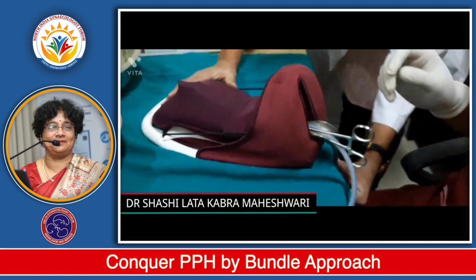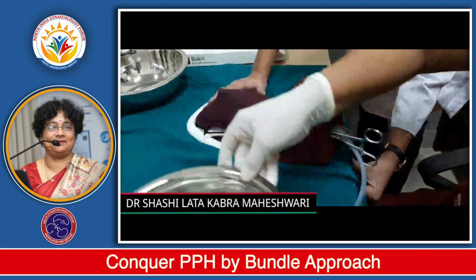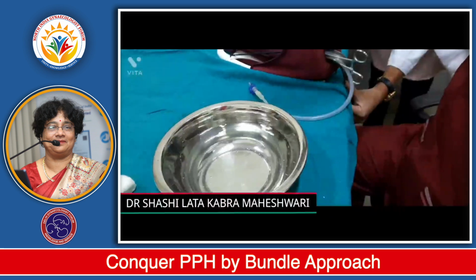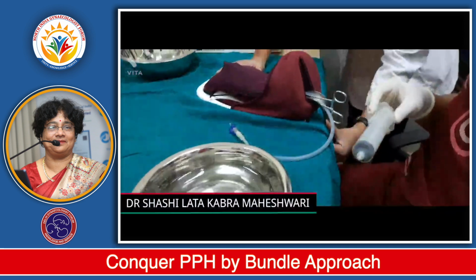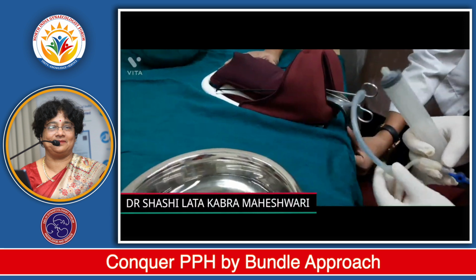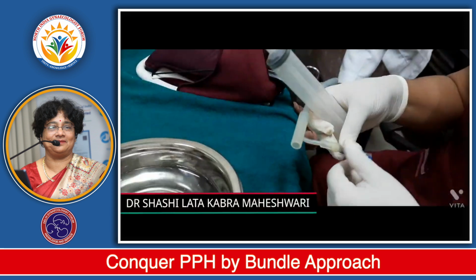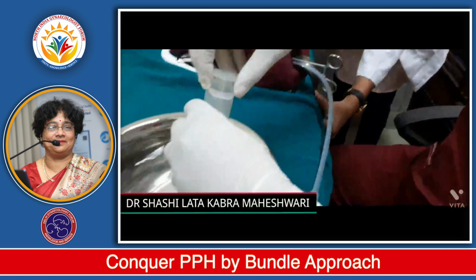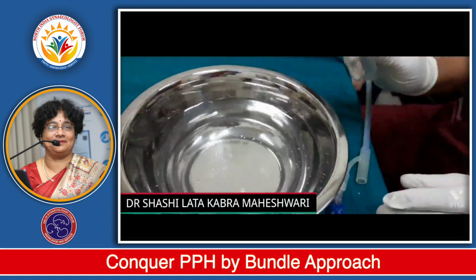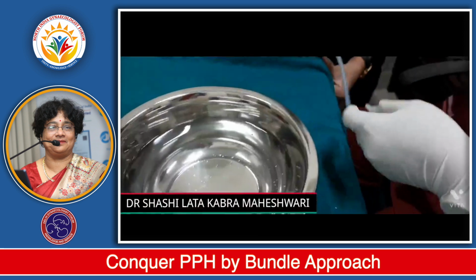Now next step is to inflate. So here we have normal saline. It is already measured. This is 500 ml. We can insert maximum 500 ml of fluid. So this is the stopcock. This is how it is closed, and this is how it is opened. And we have taken fluid, and this is a 50 cc syringe, and we will push the fluid through this.